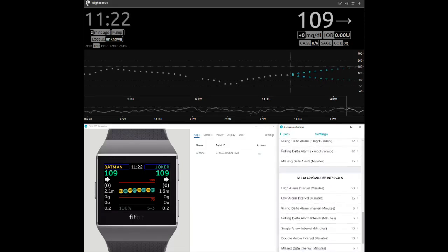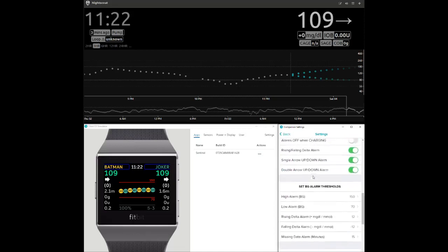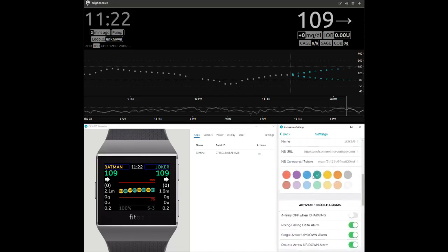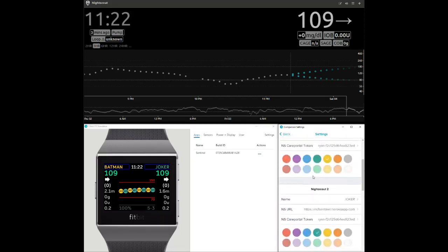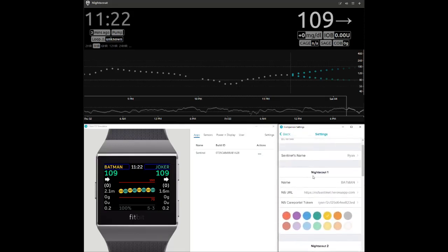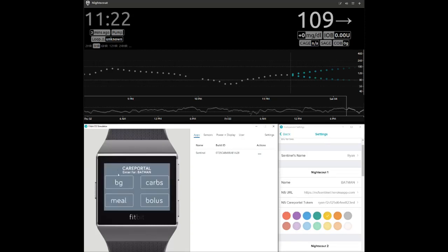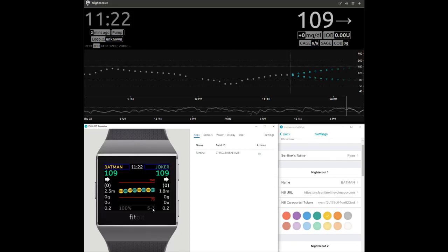Next, here is a care portal demonstration for entering a value for a BG check. Touch a name on the screen to open the care portal options window. Select BG, change the value, and press send when ready. Looking at the NightScout website above, note the arrival of a red dot on the graph with the associated information.